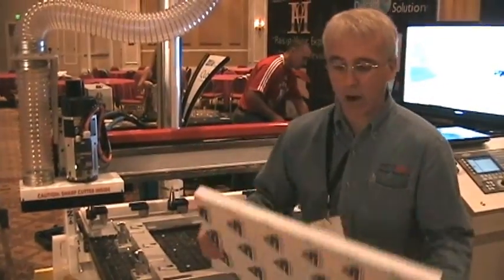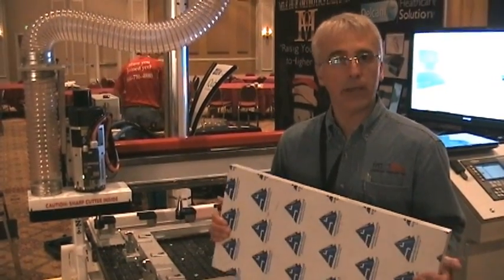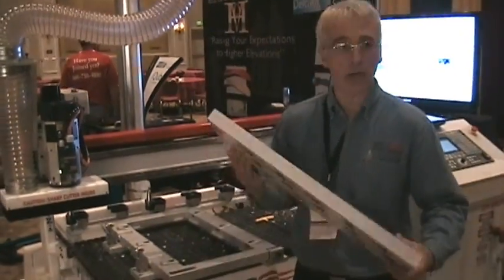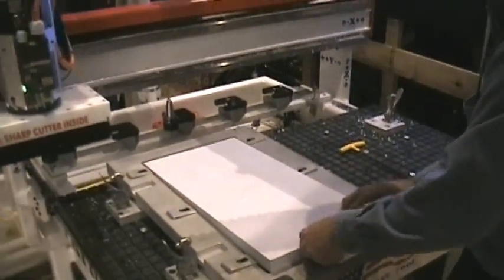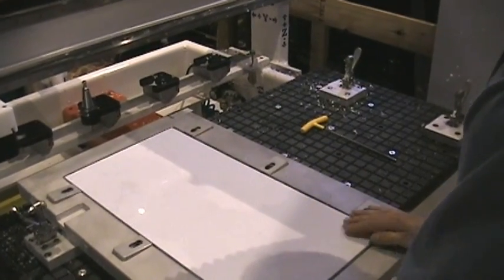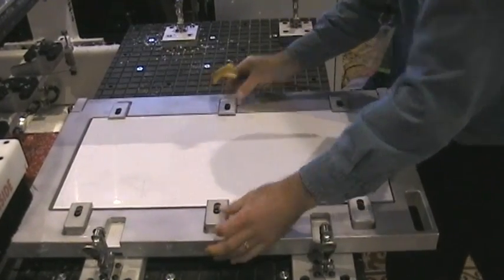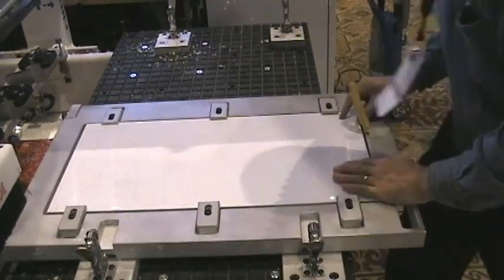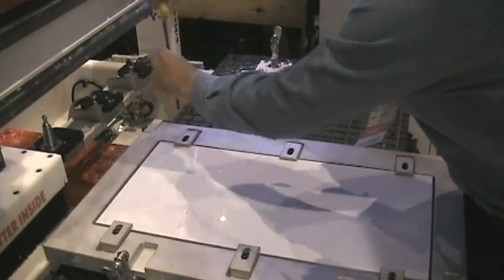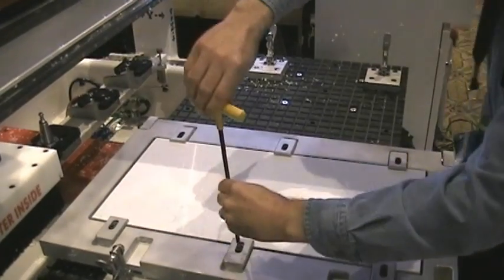Now we're ready to load our plastic blank. We can cut polyethylene, polypropylene, really all plastic and foam materials. This is an inch and a quarter of polypropylene here, and this loads right into our fixture. We center it up and line it up so we're nicely in the center of the fixture, and then we tighten down with the Allen wrench to a nice finger-tight.